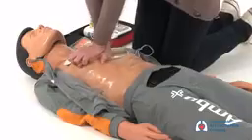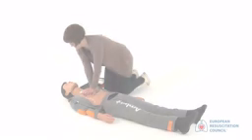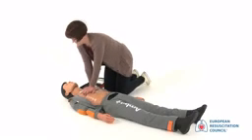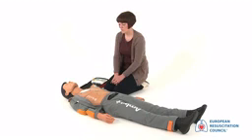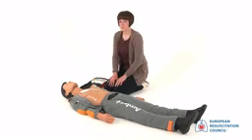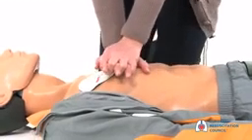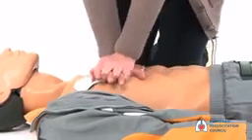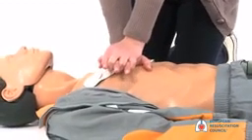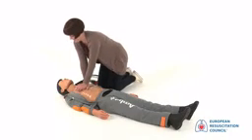When prompted by the AED, stop CPR and look to see that everyone is clear, and call "Stand clear." Analyzing heart rhythm. Do not touch the patient. Stand clear. No shock advised. If needed, begin CPR. If the AED prompts "No shock advised," start CPR again as soon as prompted by the AED, continuing until prompted by the AED.